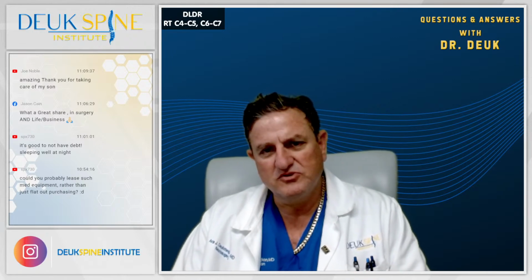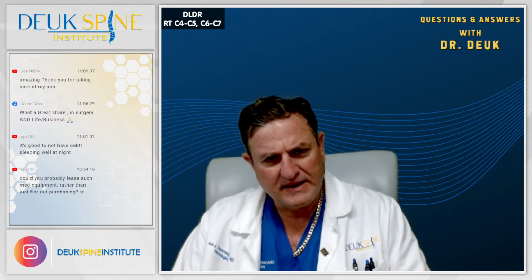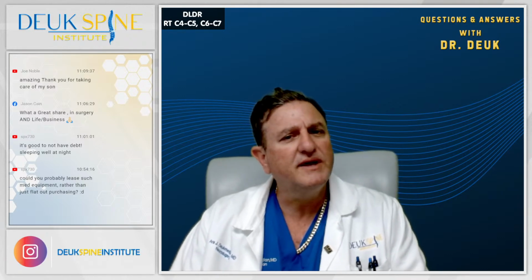The C6-7 disc, the first one I treated, we got in there, we saw a lot of herniated fragments. We saw both old herniation and new. The newer herniation is more blue, more fluffy. The older herniation was more scarred and calcified with the orange and yellow stuff. A lot firmer, a lot harder for the laser to get out.